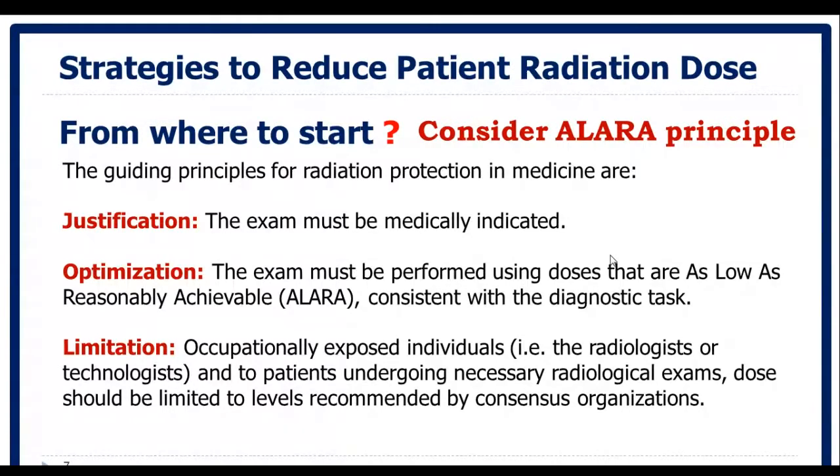After that, after collaborating all these optimization processes, and we have clear guidelines that should be followed by the different parties, then after an agreed period by the committee, we need to verify the effect of this optimization process. We need to check whether there are positive results or not, and we need to repeat dose and image quality analysis to determine the effectiveness of the optimization intervention.